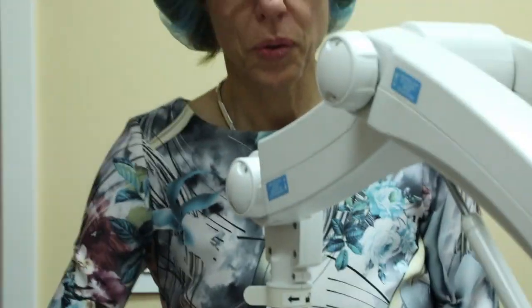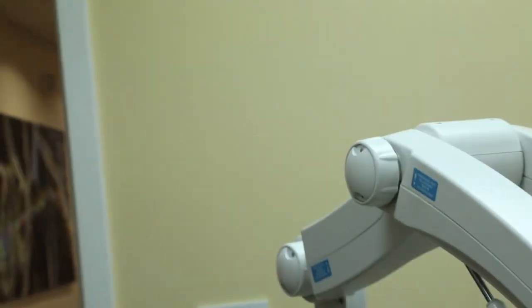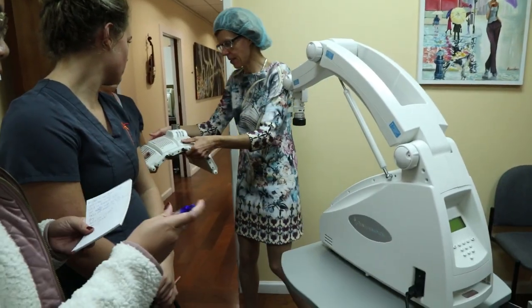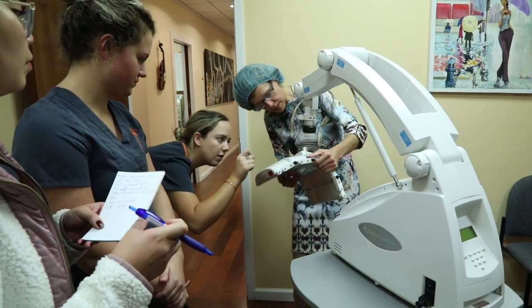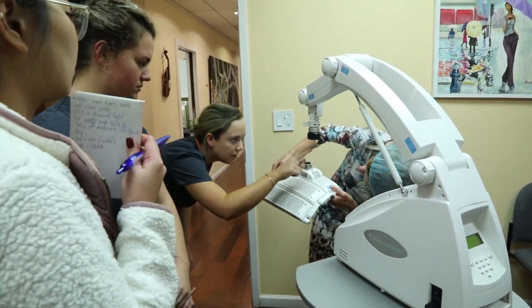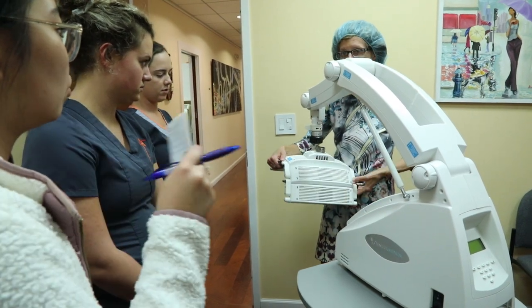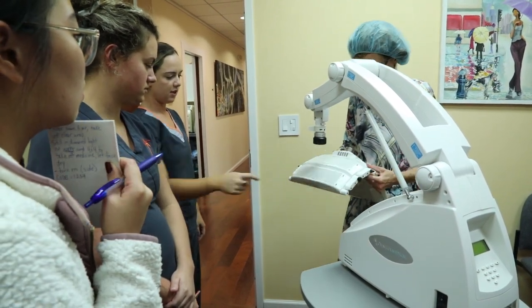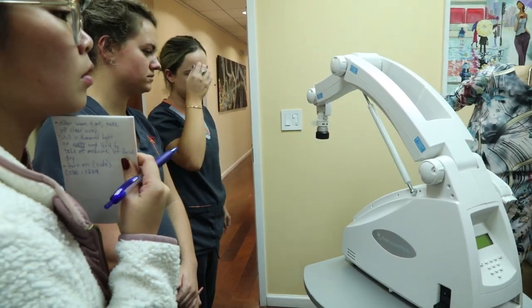Most of the time we would want to use this machine first with blue light to very quickly get the activation out. To identify the different color lights: it says 'blue' right here and then it has a black dot on the sticker.